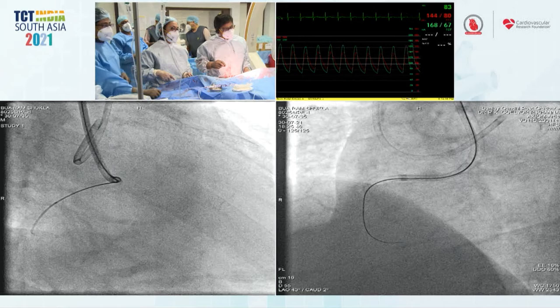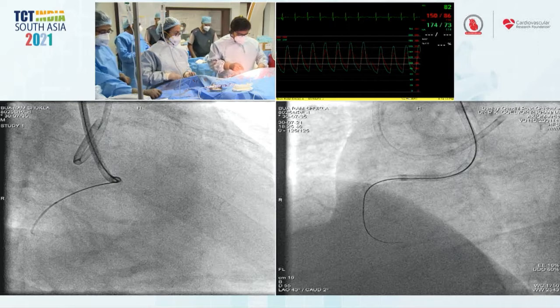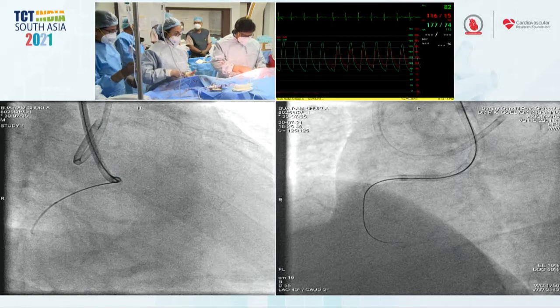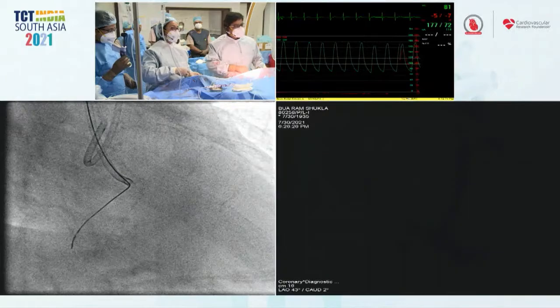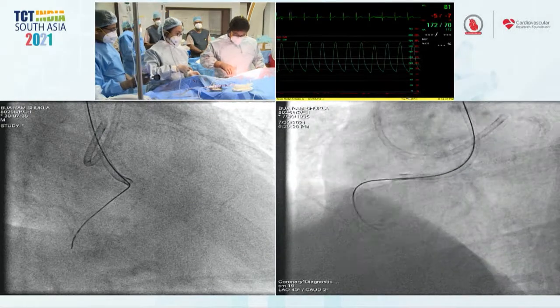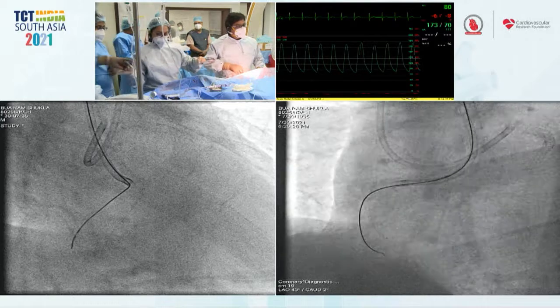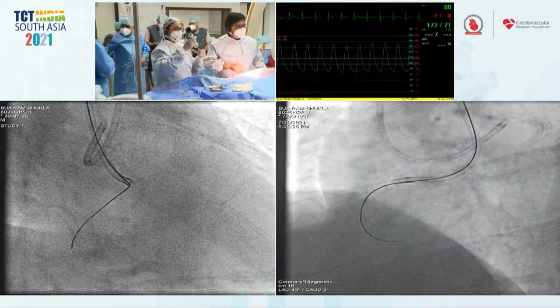I learned that from Bill. He just says deliver in the Mongo. Yeah. I have to say I haven't been doing that yet. I'm still delivering on a Miracle, especially with the LP Stingray, I feel like it gets stuck a little bit. And so I just feel like I can push harder and keep my position without further creating the subintimal space with my Miracle. So I'm still to be honest using the Miracle.